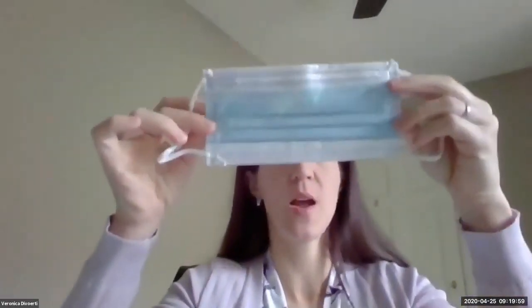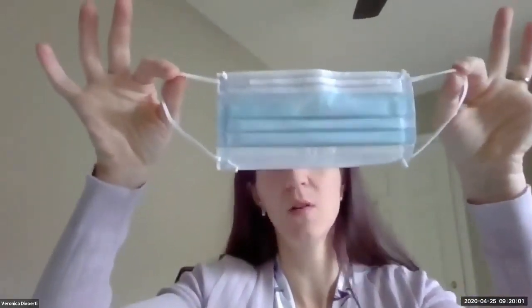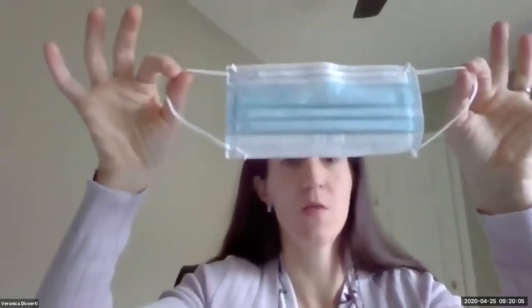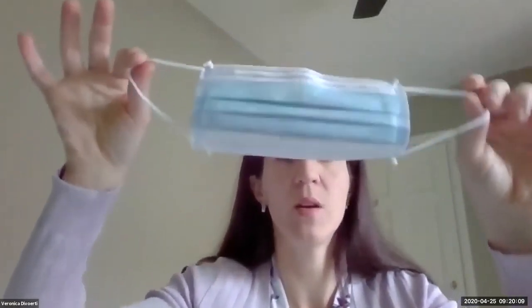This is the mask that you'll see around. We call this a procedural or surgical mask — this is the one you'll see around for the most part. Always grab your masks by the handles on the sides. You've got to make sure that you expand the mask, cover your nose and your mouth, and then push down this little rim up here so that it mimics the bridge of your nose and your face.